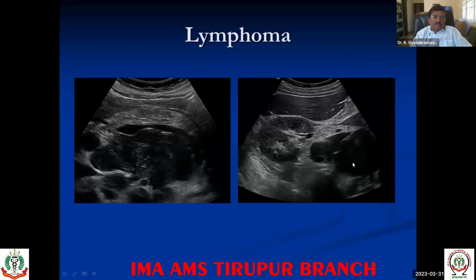So when you see large lymph nodes with fever, the possibility you think of could be tuberculosis or it could be a lymphoma. So this case on biopsy proved to be a lymphoma.